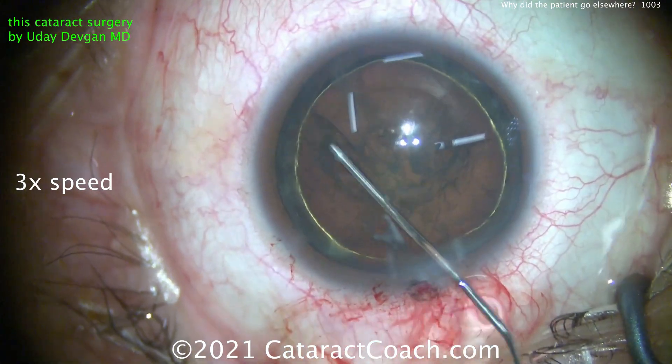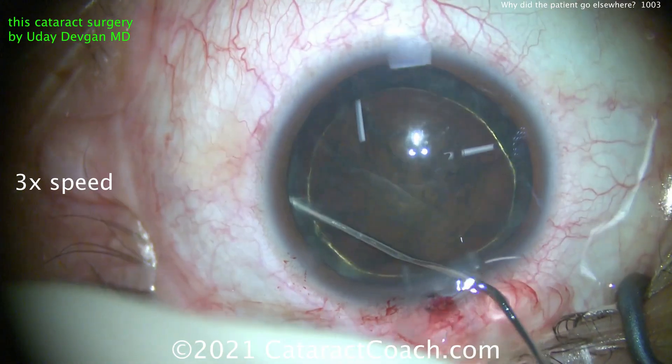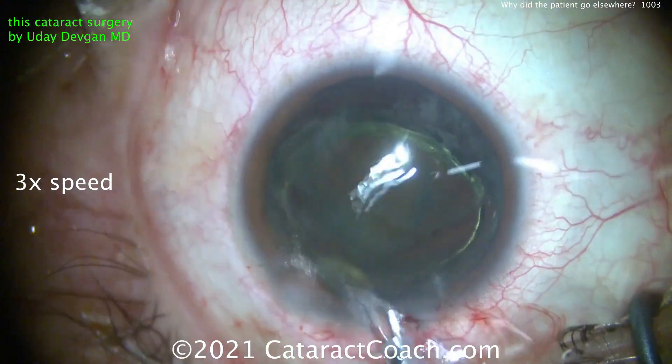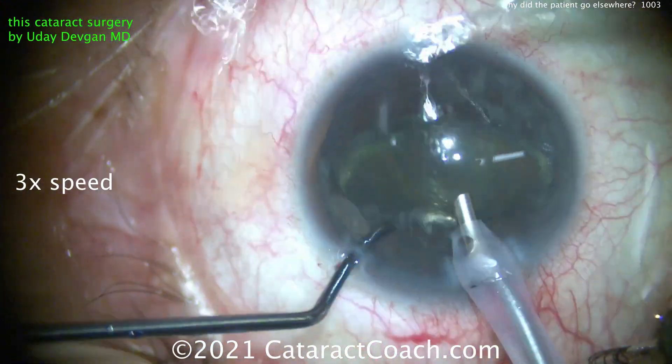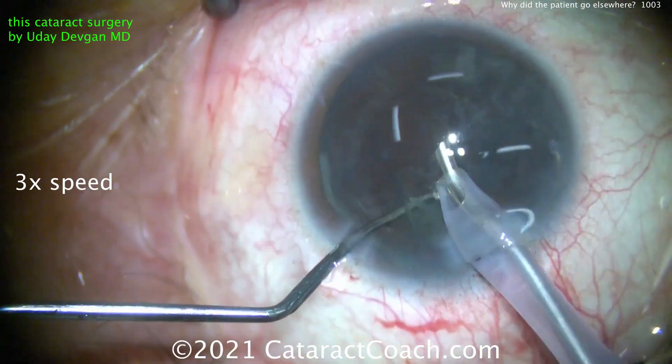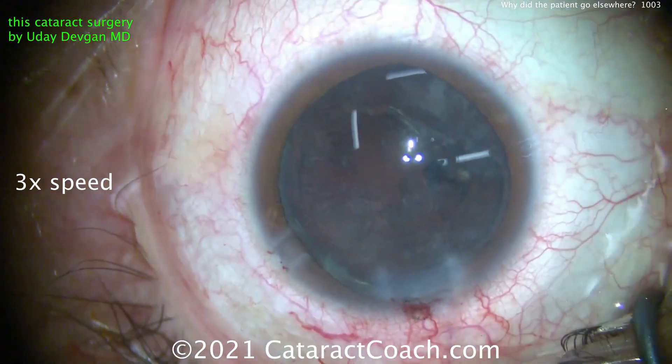Now creating our capsulorhexis here. A patient like this has a lot of glare already from oncoming lights at night because of that anterior cortical cataract. The patient and I had lengthy discussions in the preoperative examination and we decided the best option would be to do a trifocal IOL to give the patient the widest range of vision without glasses. This patient is relatively young, about 50 years old.